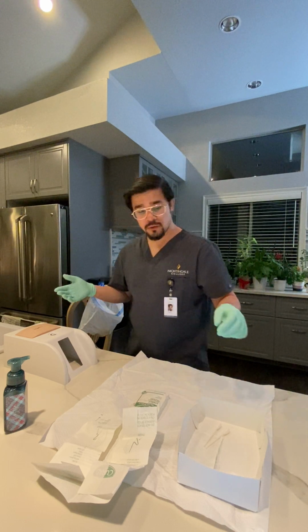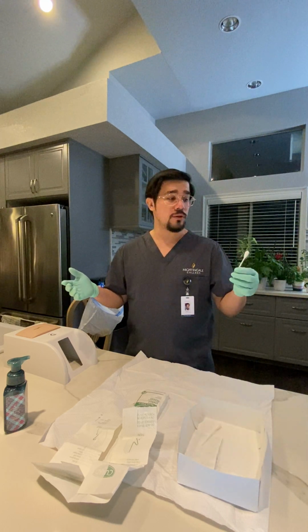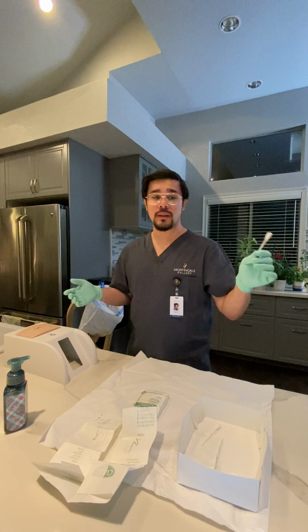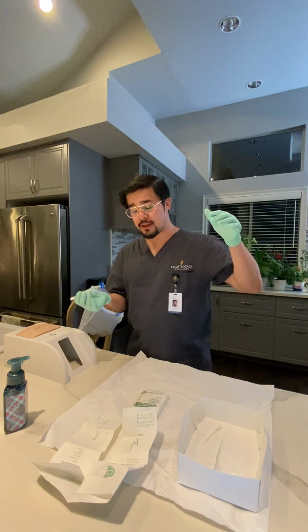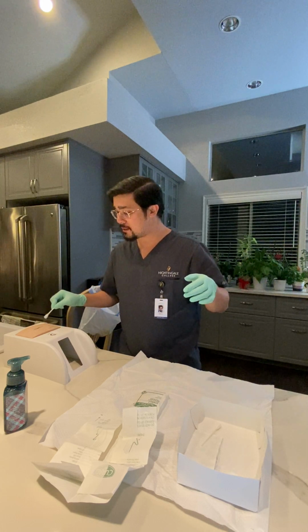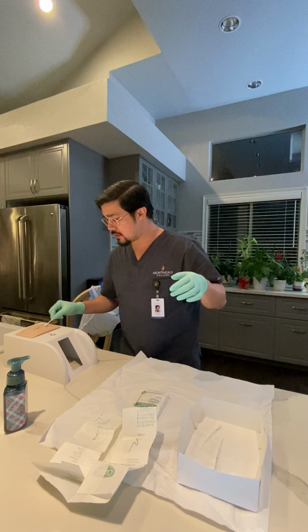So as I'm assessing the wound, I am going to use the alcohol swab that I have here. I would ideally want to use a chlorhexidine prep, but the kit that I had did not come with one, so in lieu of it, I'm going to use the alcohol swab. I'm going to take it from my left hand, drop it into my right hand, and begin cleaning the wound. Starting from the inside, as I do one pass, I will start from the wound on the inside and work my way towards the outside.